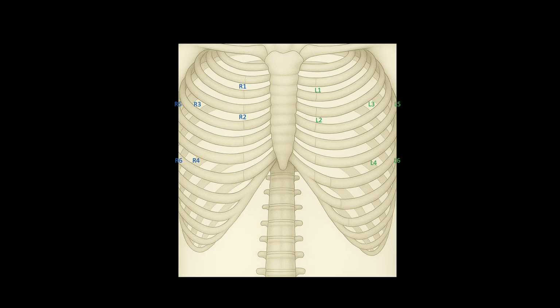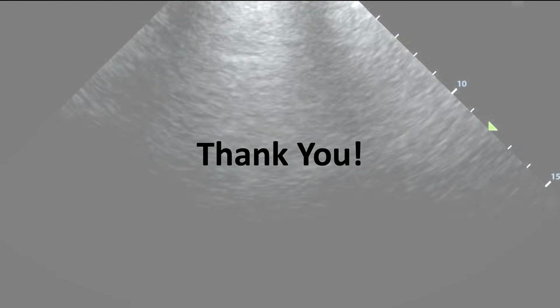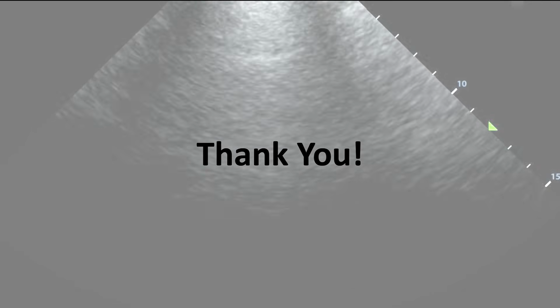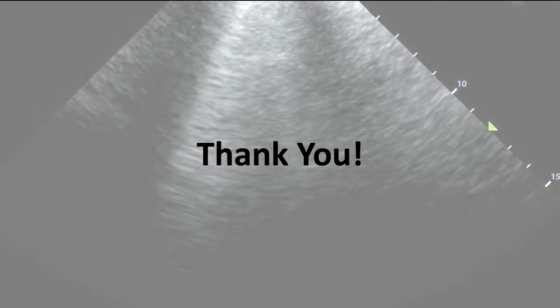The left-sided scanning landmarks are mirror images to the right-sided scanning points. Thus, once you've mastered scanning one side of the chest, you can apply the exact same techniques to the other side of the chest. After watching this video, the most important thing you can do is apply these concepts in real life by practicing lung ultrasound on patients.